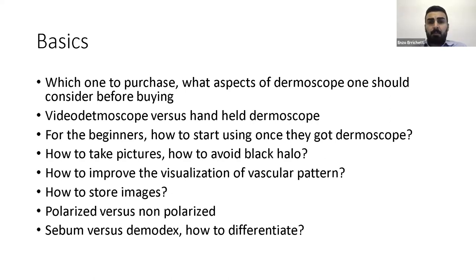Yes, we already discussed it. I deeply agree with you. I think that the sebum is broader and shorter and has the follicle, the hair, while on the other hand, in demodex, we have thinner and longer structures. In my opinion, in fair skin we do not see sebum. I do see it in patients with darker phototypes, but in fair skin we do not see sebum. So this is an issue, especially for darker phototypes. But as we discussed, I think that these are the differences.